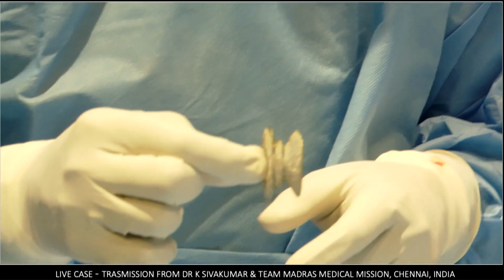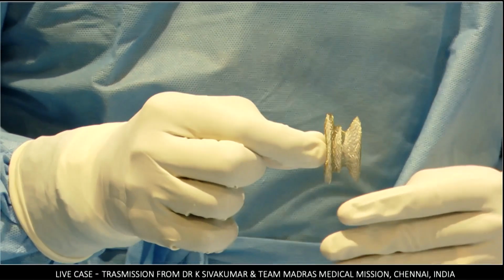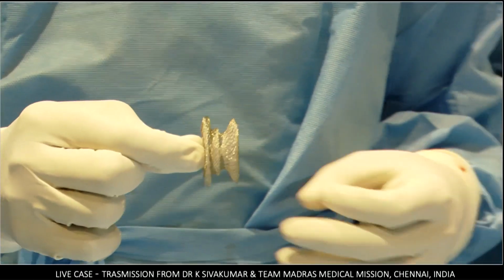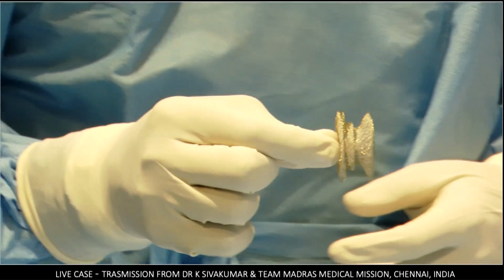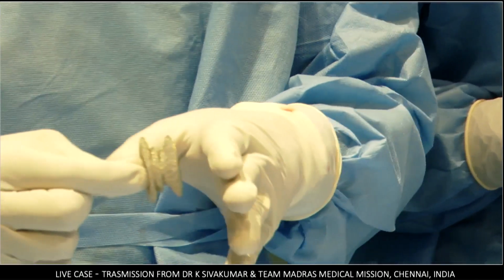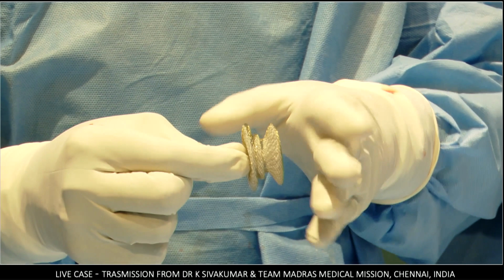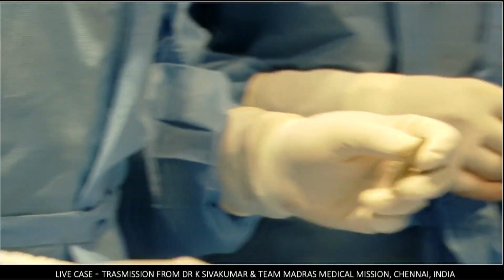But one thing is that the number of devices is very less. Because it is covering three sizes, the total number of devices starting from say 10 millimeter to 40 millimeter, there are only 8 devices. So that makes the inventory easier. Now, I have to see how it behaves within the heart. First things first, start with the live.